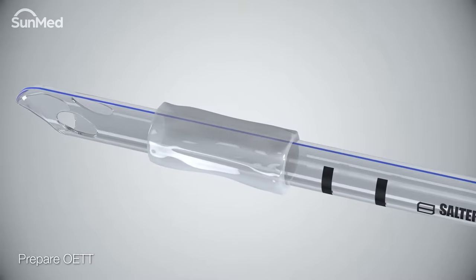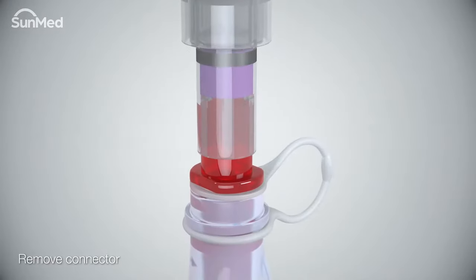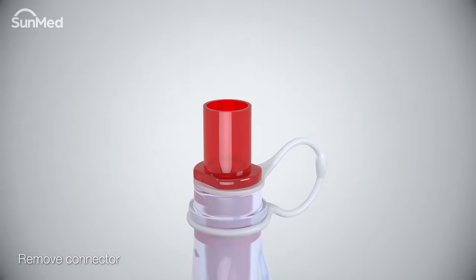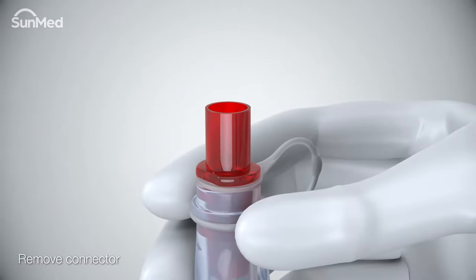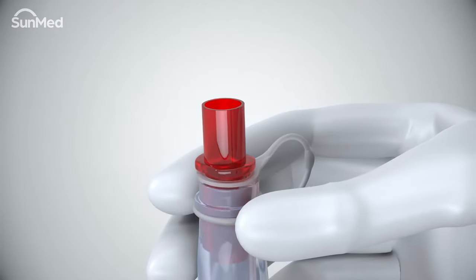Use a water-soluble lubricant and generously lubricate the tube and cuff. Next, disconnect the air Q3 airway from the breathing circuit and remove the tube connector. To remove the connector, place the airway tube between the index finger and thumb just distal to the connector, then rock the air Q3 connector back and forth while pulling it outward away from the airway tube.